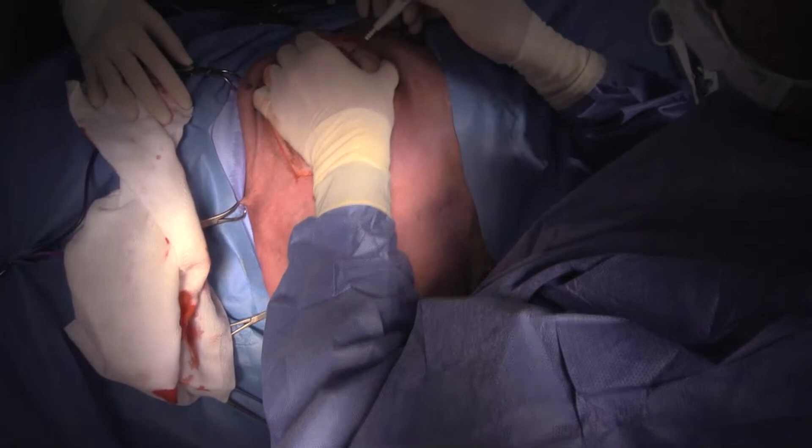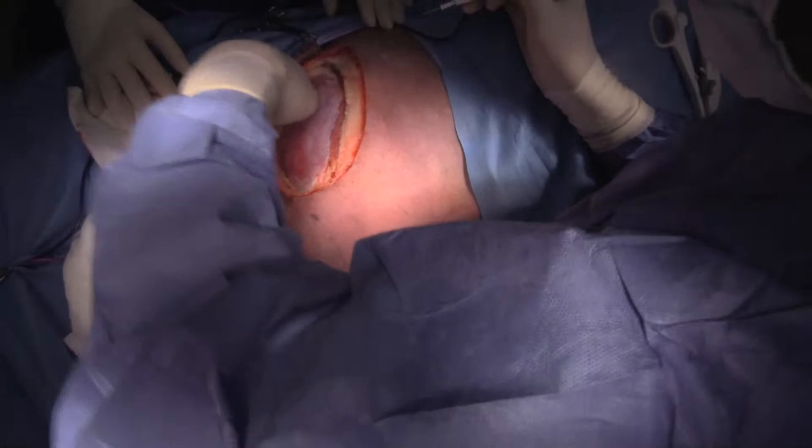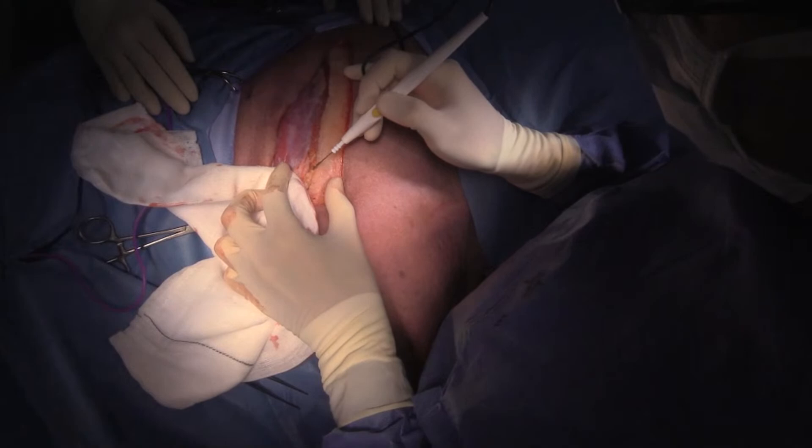We're getting some twitching here. For everybody who's watching, it's not because the dog is waking up — it is because of direct muscle stimulation. So I've gone through omotransversarius and trapezius muscle here.